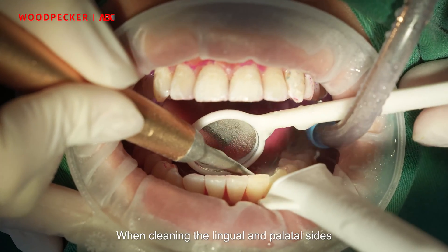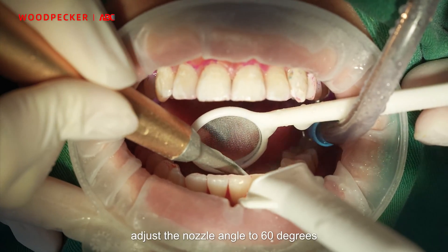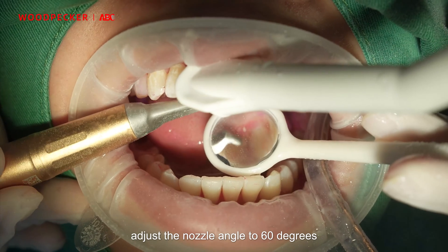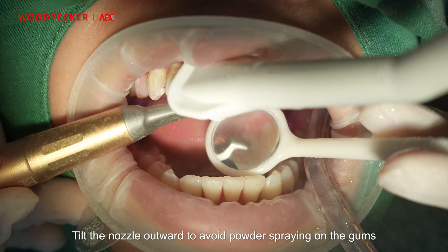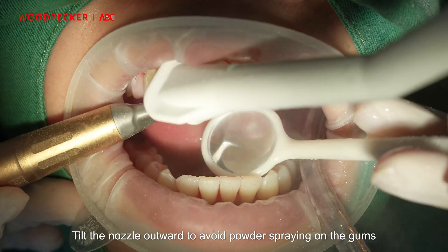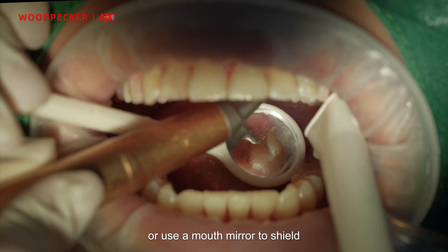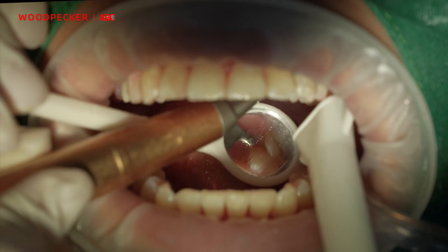When cleaning the lingual and palatal sides, adjust the nozzle angle to 60 degrees. Tilt the nozzle outward to avoid powder spraying on the gums, or use a mouth mirror to shield.